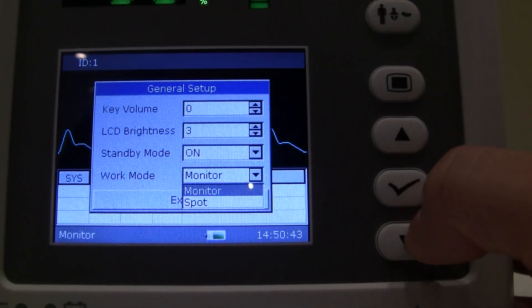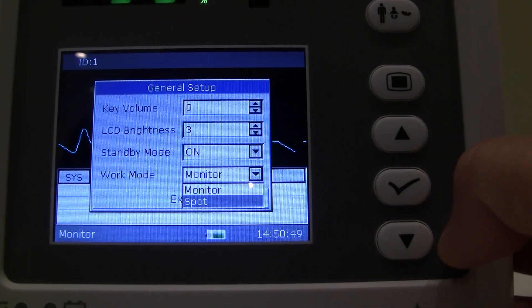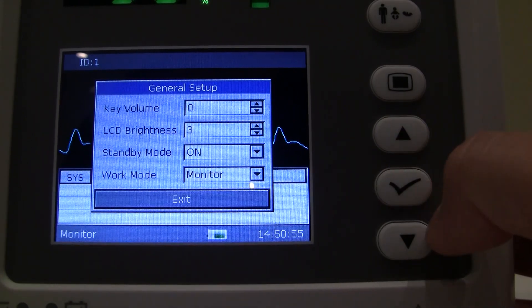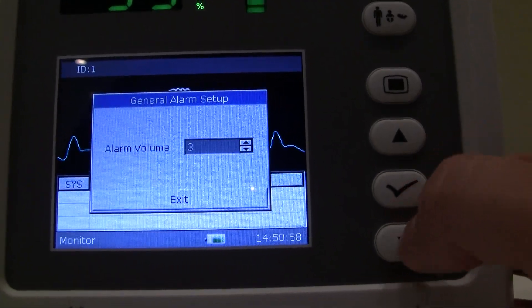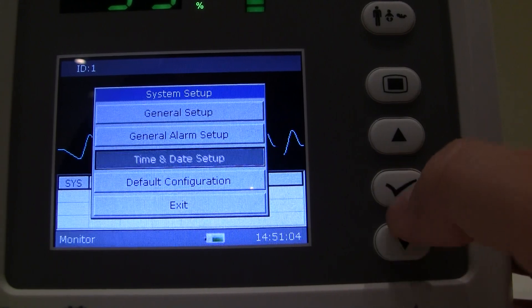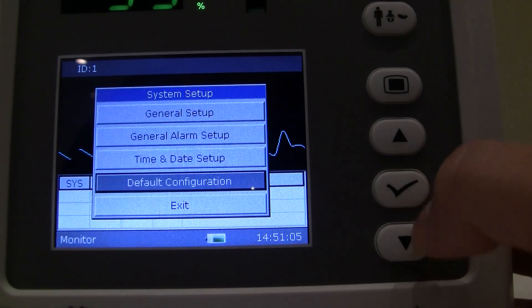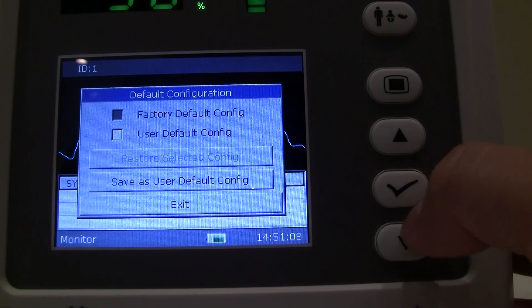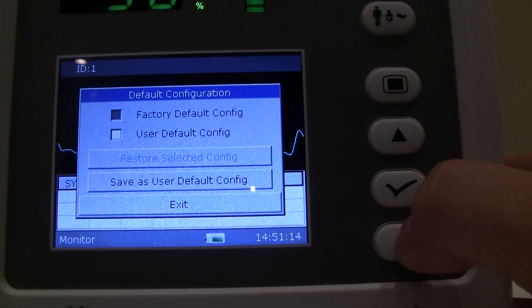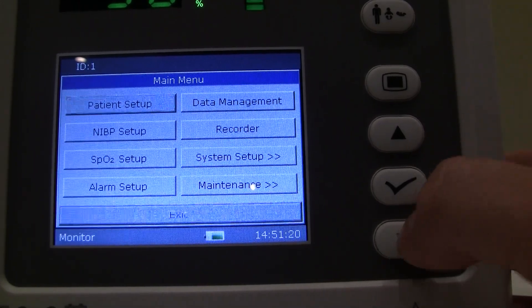Work mode is very important — right now it's set to monitor, but you can also select it as a spot vital signs monitor. If you're simply checking inpatients, you would want it on spot. For continuous monitoring, put it on monitor. General alarm setup is where you change the volume for your alarm. Date and time is pretty self-explanatory. Default configuration lets you restore factory default settings, while user default configuration saves any of the settings from the previous screens.